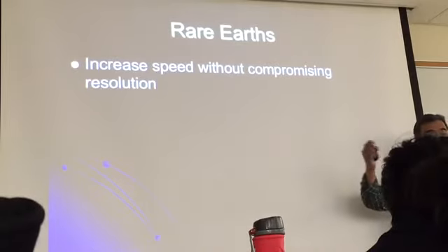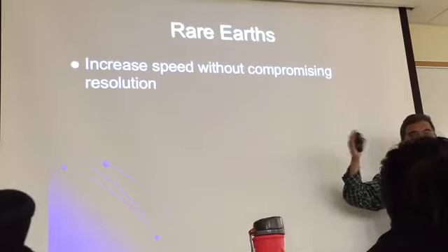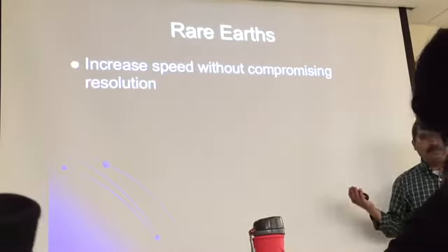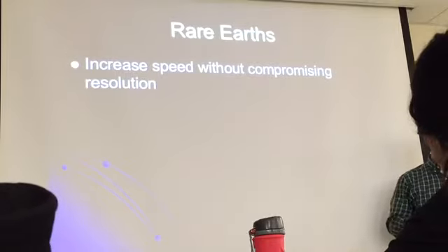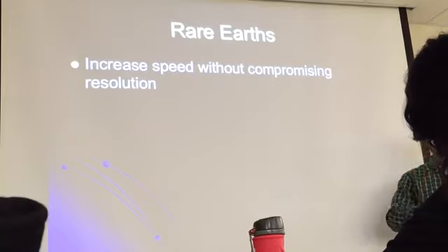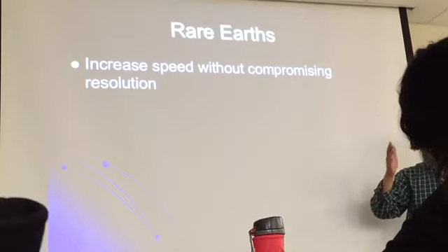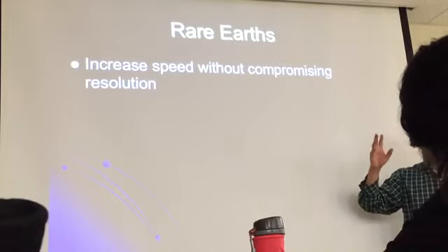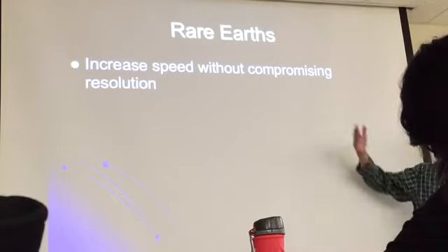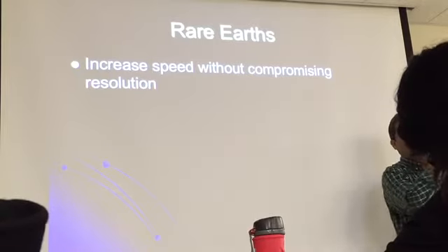Remember, last time I was telling you the naked eye can see approximately 10 lines per millimeter, and if you're showing 100, what's the point? Your eye is not going to be able to see it, right? That's what you were getting with direct exposure film. With rare earths, you can do about 5 lines per millimeter, 7 lines per millimeter, which is pretty good. What do you think computerized systems will do?